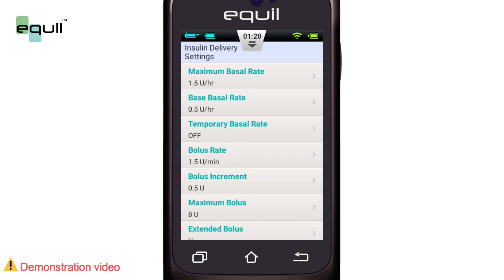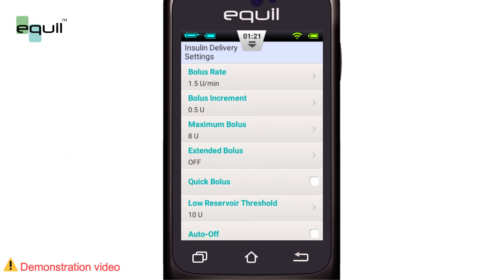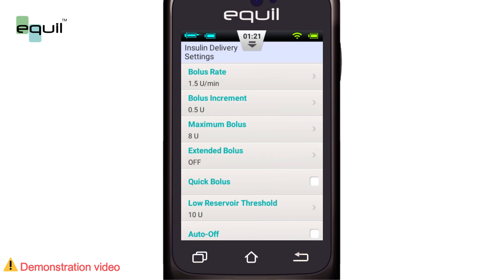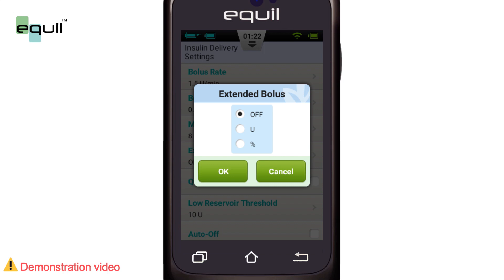Try setting this value as the maximum bolus you would normally give. Setting this value too high increases the risk of overdosage by mal-operation. We can also set the extended bolus — it defaults to off and grays out its corresponding button. We can activate it and select the amount of insulin to be delivered now, displayed in units of insulin or as a percentage of the total bolus amount.